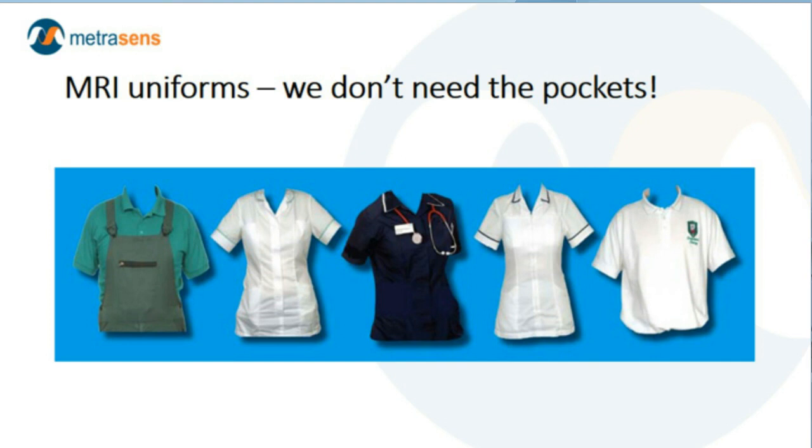Okay, it might not make us very popular with non-MRI staff, but it will underline that MRI radiographers and technicians have the authority in MRI to either permit or not permit anyone to enter the scan room, because they are ultimately responsible for this front line.